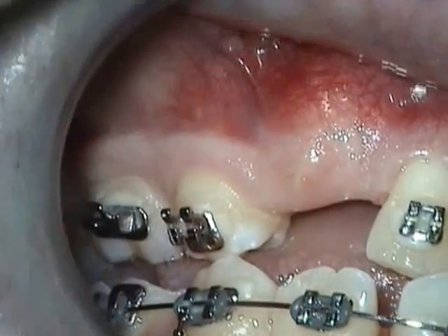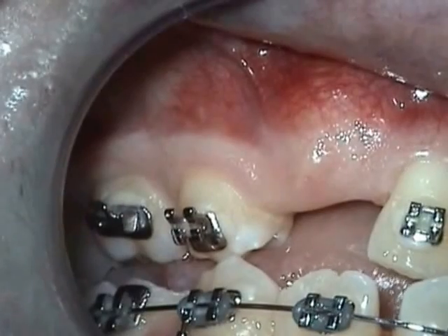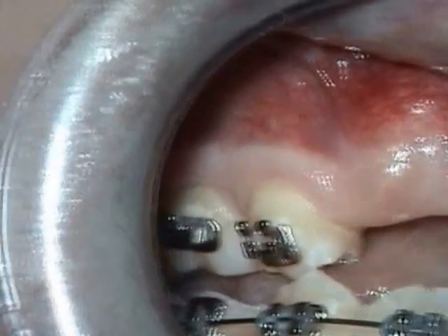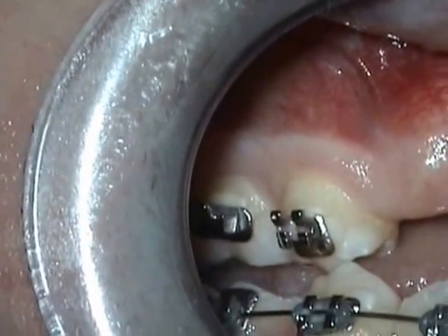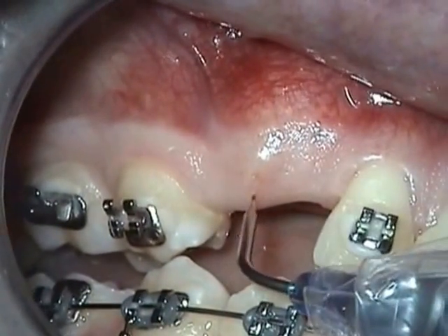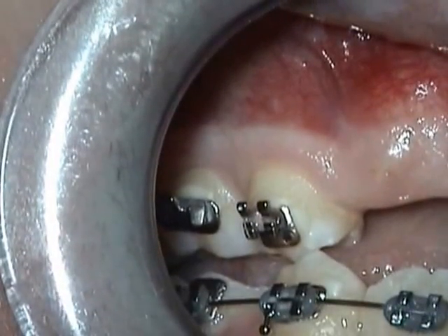Set your laser at 1.4 peak power, giving you a 0.93 resultant average power with a pulse interval of 10 ms and a pulse length of 20 ms.